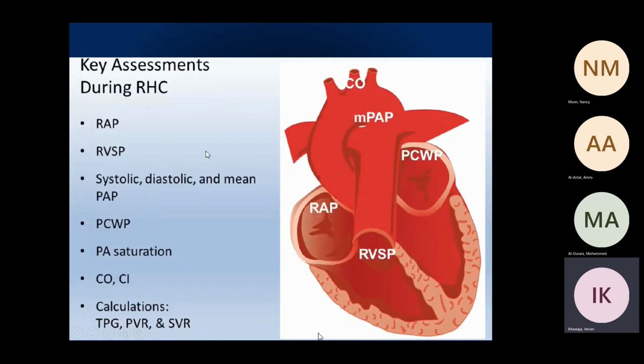Okay, now what you get from the catheter as far as measurements: several things. There's no doubt that there's a plethora of information that you gather from the Swan-Ganz that you can't get any other way. Some of these are directly measured parameters, some of these are calculated. The directly measured ones, of course, are right atrial pressure or CVP, and RV pressure, and you get that as you pass your catheter. That's the only time, because you don't want to stay too long in the RV. You pass the RV quickly, otherwise you will induce arrhythmia.